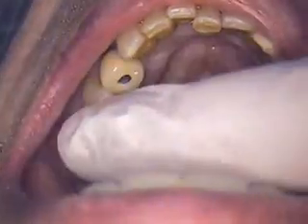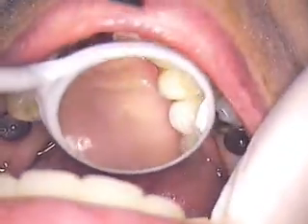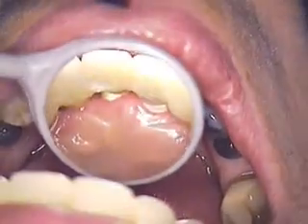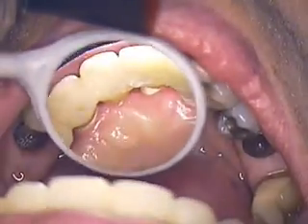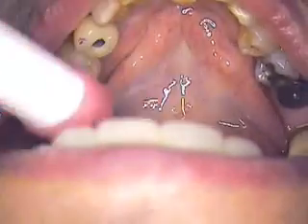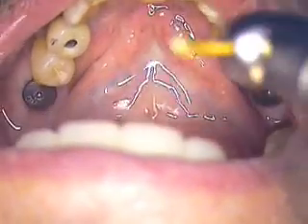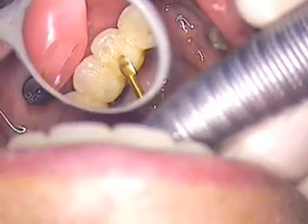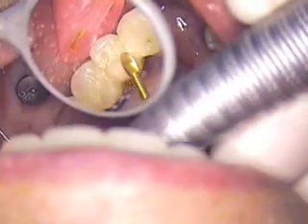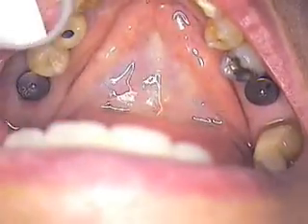Now we're going to check occlusion. I use AccuFilm II articulating paper. We did build up his bite a little bit on this lower left and right side, as covered earlier in the diagnostic wax-up section. Now we're adjusting the opposing arch. The upper arch contains seven bone-level implants and a complete one-piece plastic temporary cemented in with temporary cement. The upper left first bicuspid needs some adjusting, so I'll use a fluted carbide — a gold fluted carbide from the Neo Burr company — and adjust that. I'll continue adjusting the occlusion until we have good contact on both implant and natural teeth.